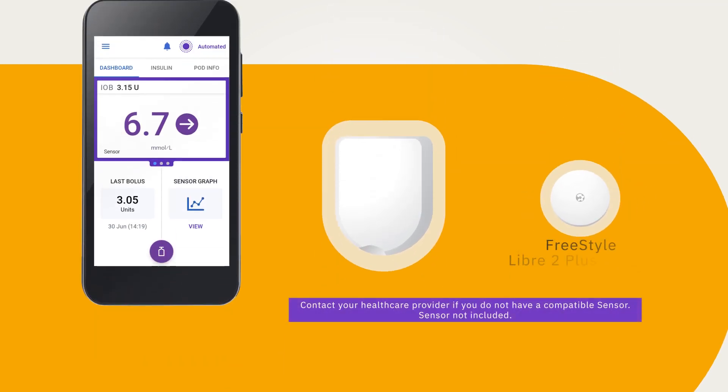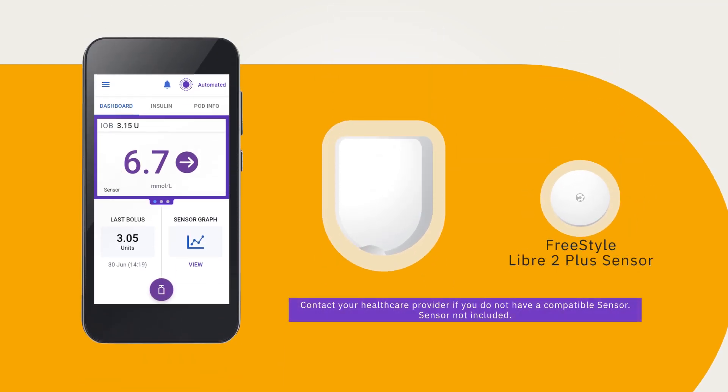To use the system in automated mode with a Freestyle Libre 2 Plus sensor, you must start the sensor with the Omnipod 5 controller. The Omnipod 5 controller is used to start and stop your sensor and display your customizable glucose alerts and alarms.